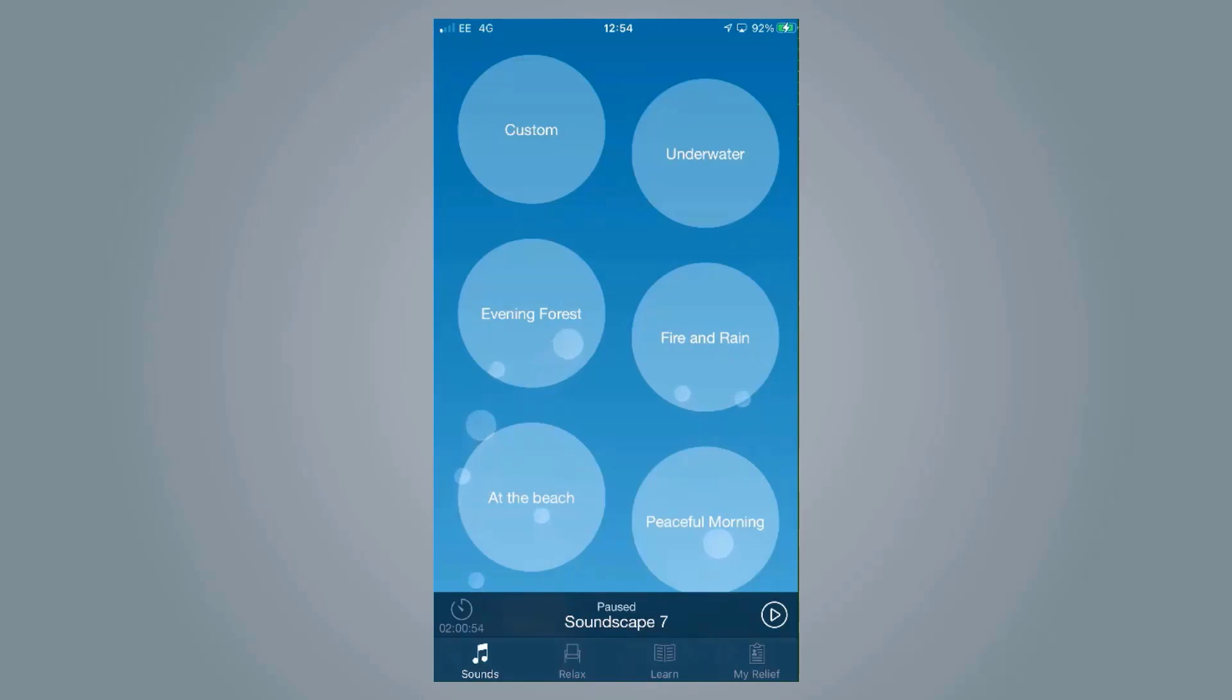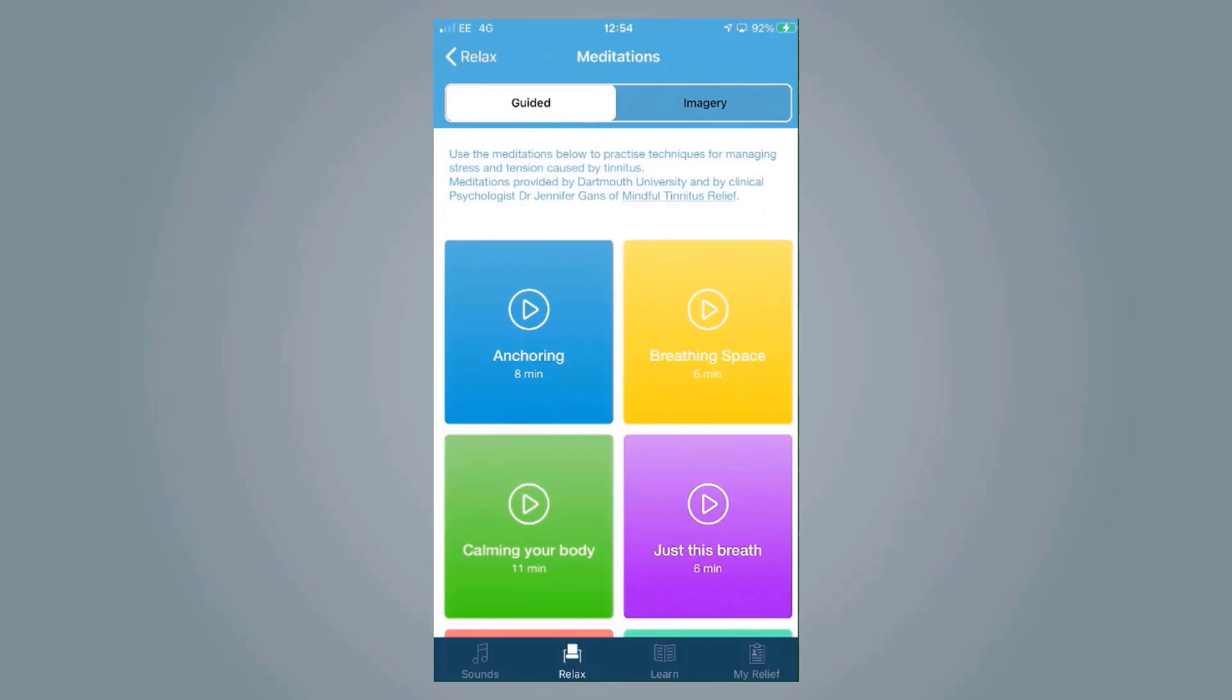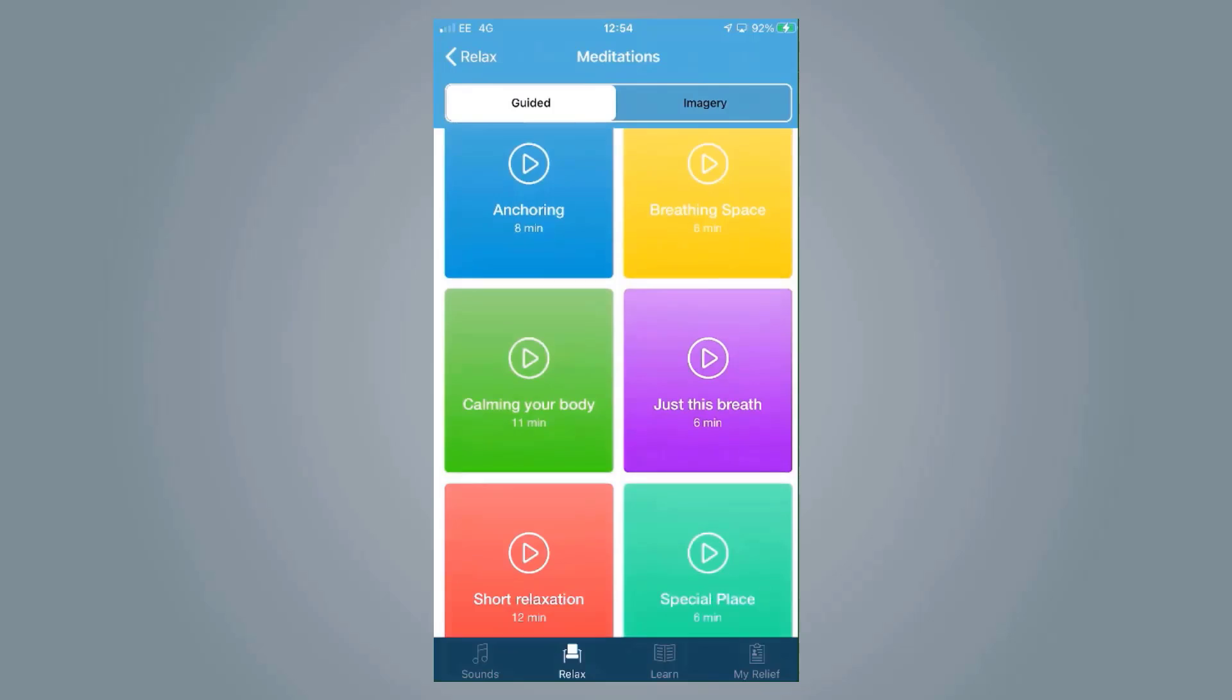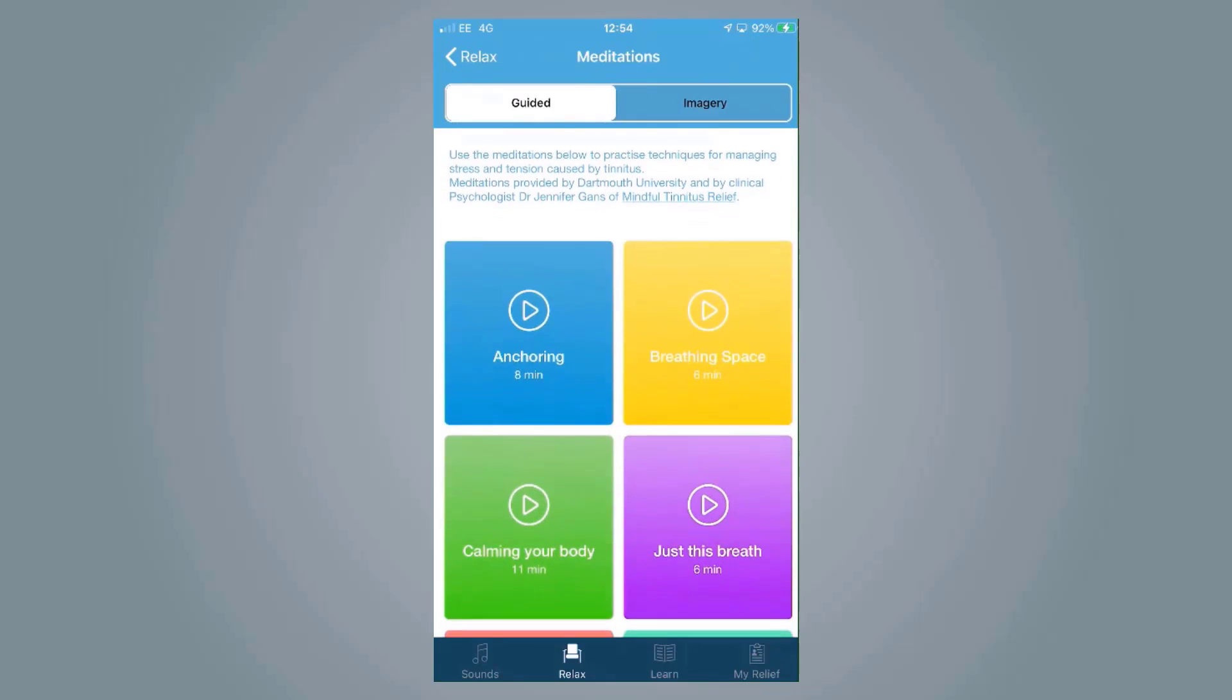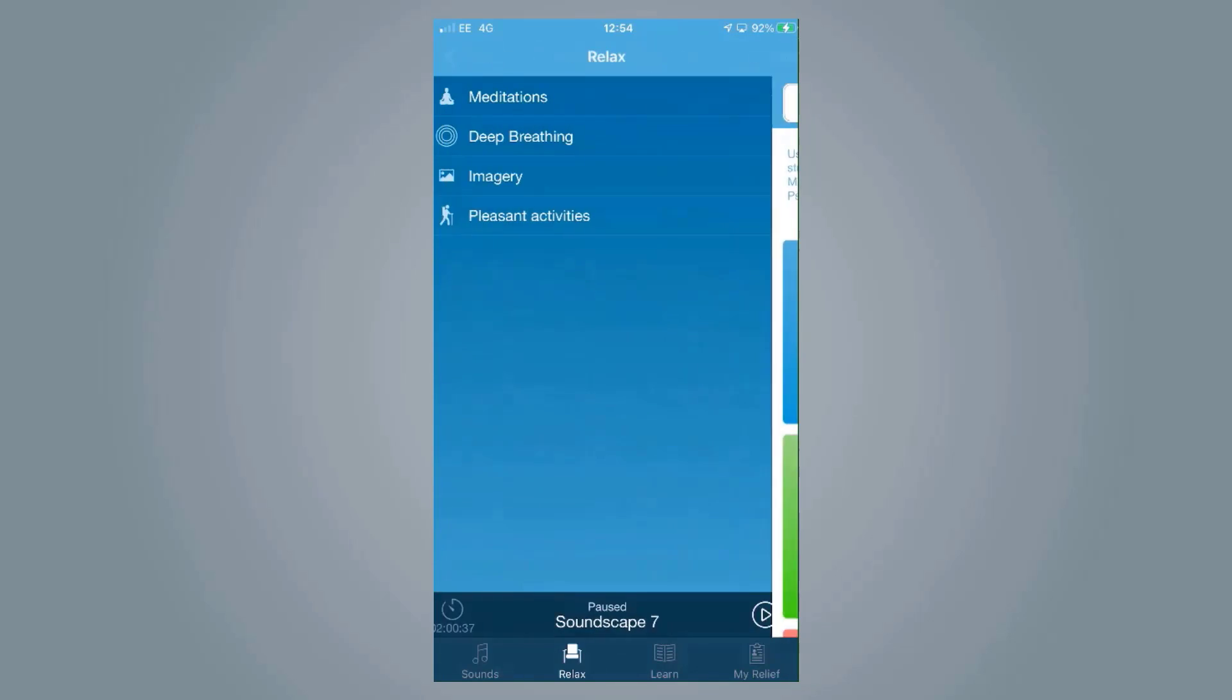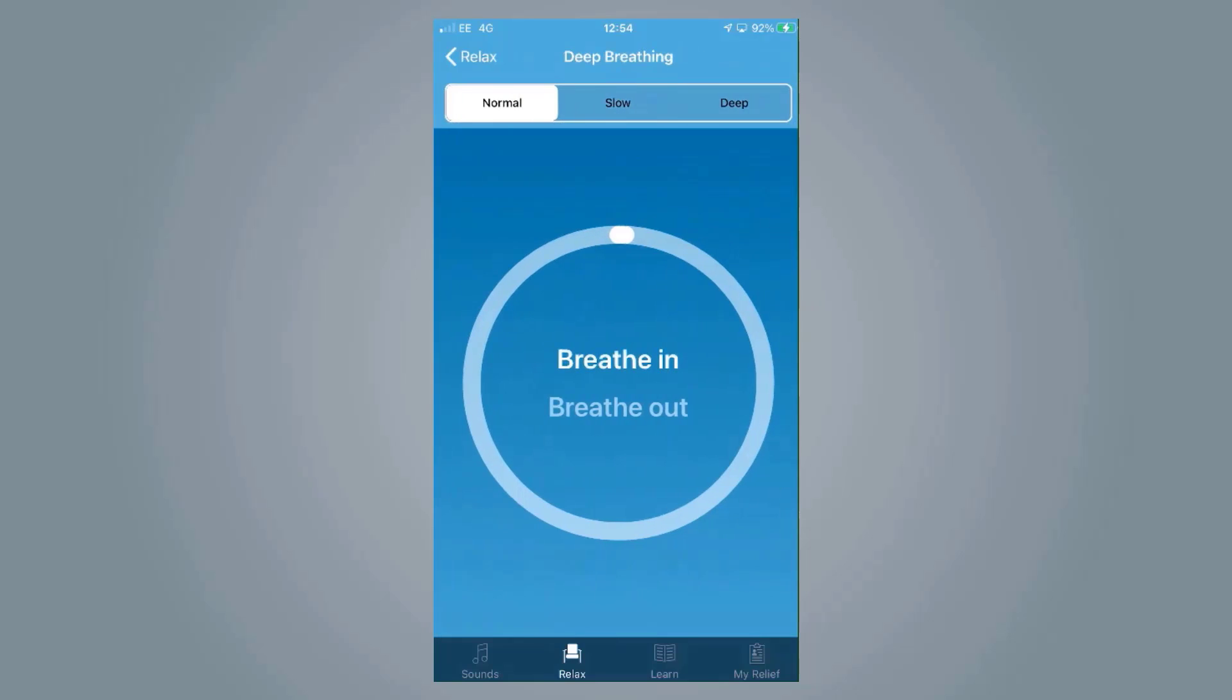Within the app we also have things like Relax, which is really useful for helping people to deal with this tinnitus if it is a big problem for them. We have meditation tips with different videos and audio clips, deep breathing techniques telling you when to breathe in and breathe out.